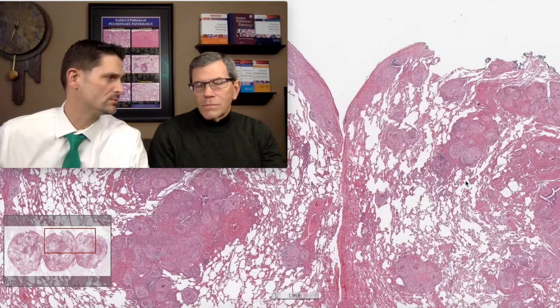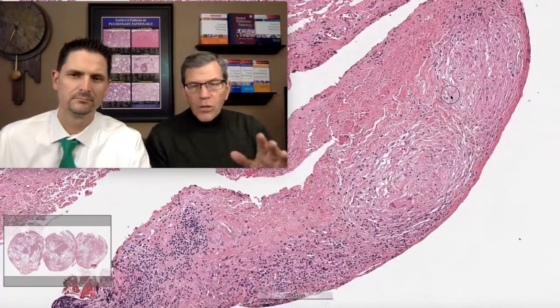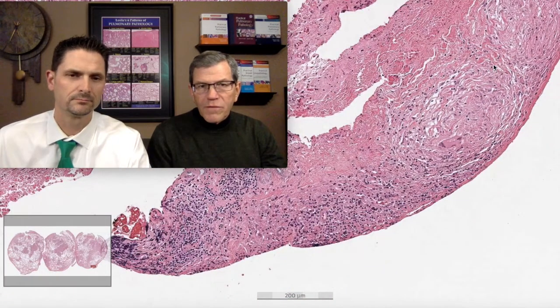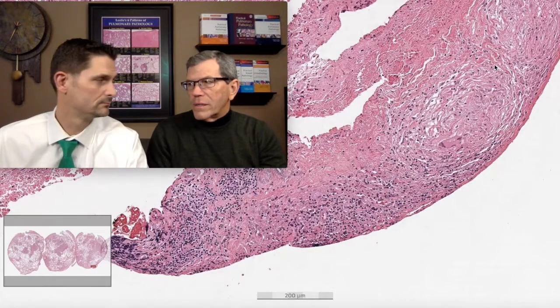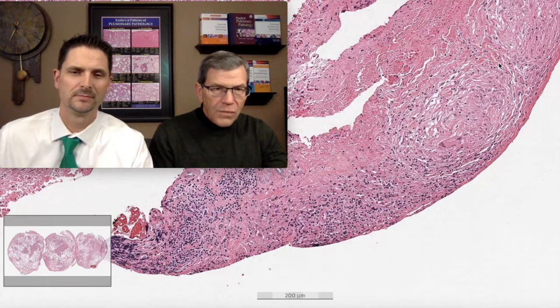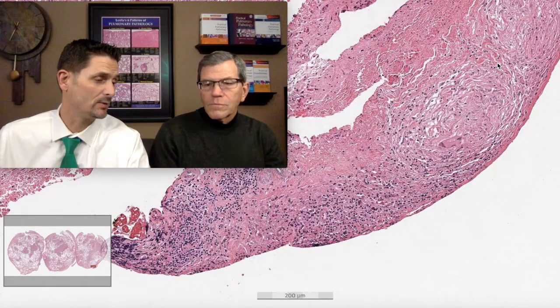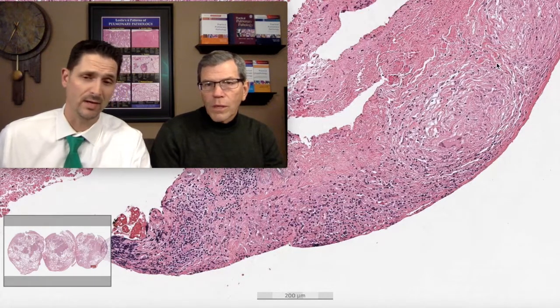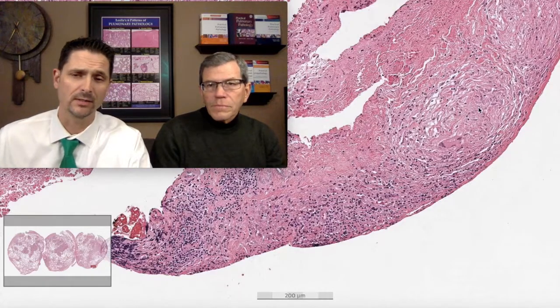Should we do stains on this case? Any time you see granulomas you do stains — AFB and GMS. If you don't, it appears you didn't think of it. Even if you're confident it's sarcoid, do the stains; they'll be negative but it looks appropriate in your report. You will get calls from infectious disease asking if you're a pathologist who didn't do stains on a granuloma. You may not need to do it on every block — just one. Here's a beautiful pleural granuloma.